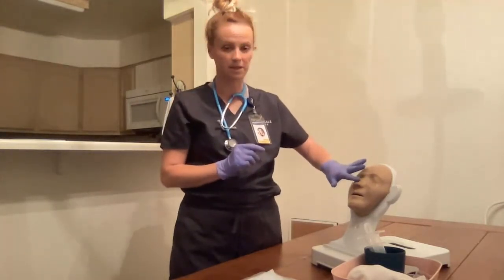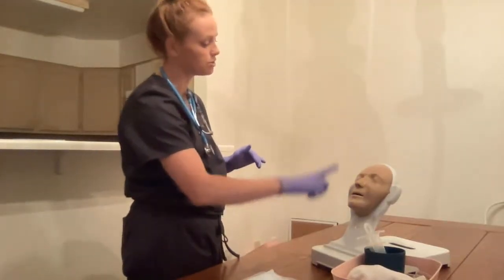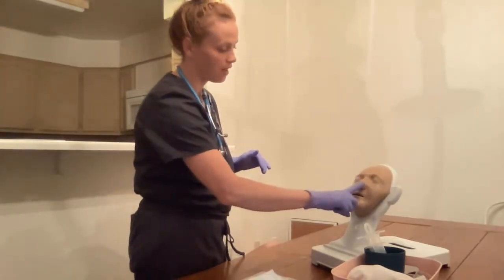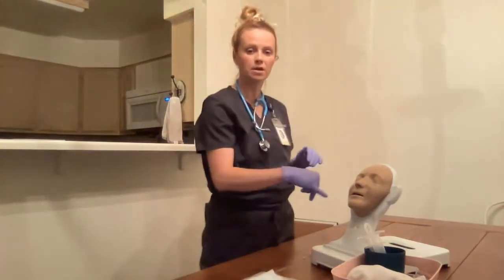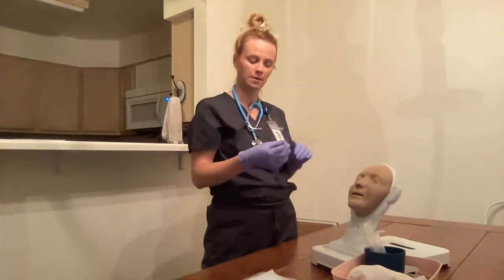Her septum appears midline. Next, Mrs. Smith, I'm going to press on one side of your nose here. I want you to breathe in and out of the other side, and then we'll reverse, okay? Breathe in and out. Good. Other side. Good job. After assessing my patient, it appears that her right nostril has better airflow, so that's the side that I'm going to place the NG tube in.